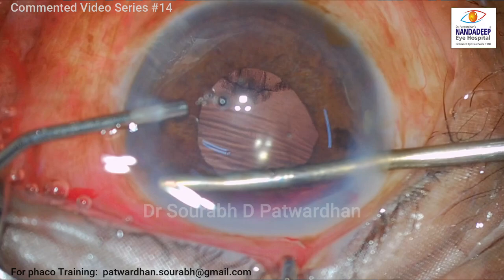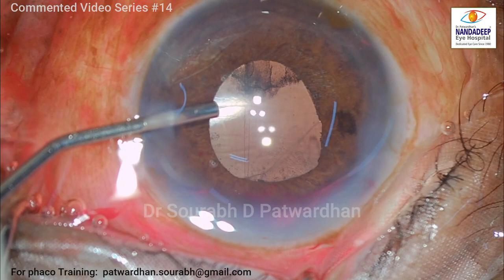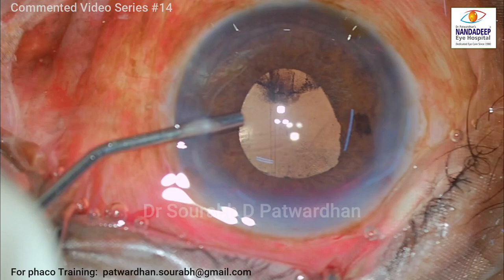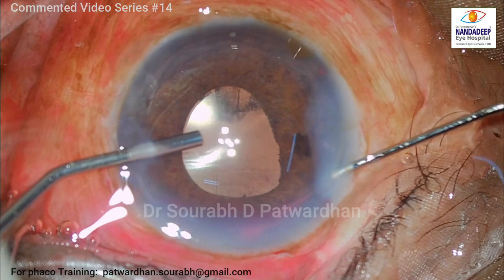Avoid overzealous removal of the clot — that's the take-home message here. Also, use the vitrectomy probe for removing the organized blood or clot rather than trying to use the Simcoe. I am trimming off the visible clot. The remaining clot that is adherent will liquefy over the next seven to ten days and will get absorbed. We have to continue anti-glaucoma medication, steroids, and cycloplegics to minimize inflammation and raised IOP in the postoperative period.